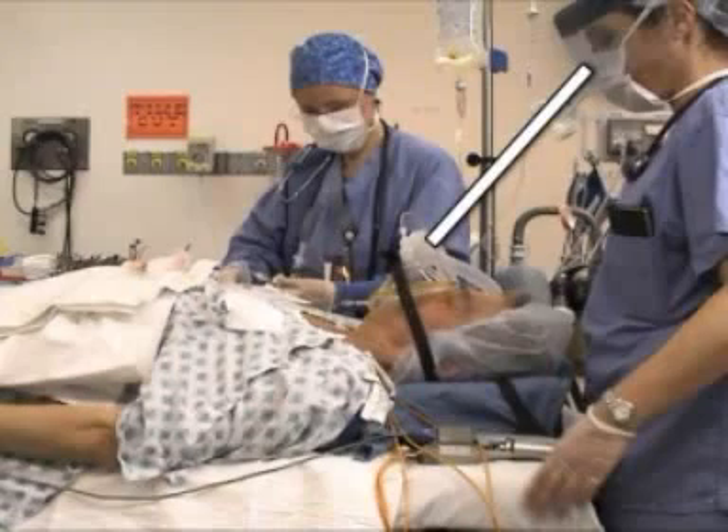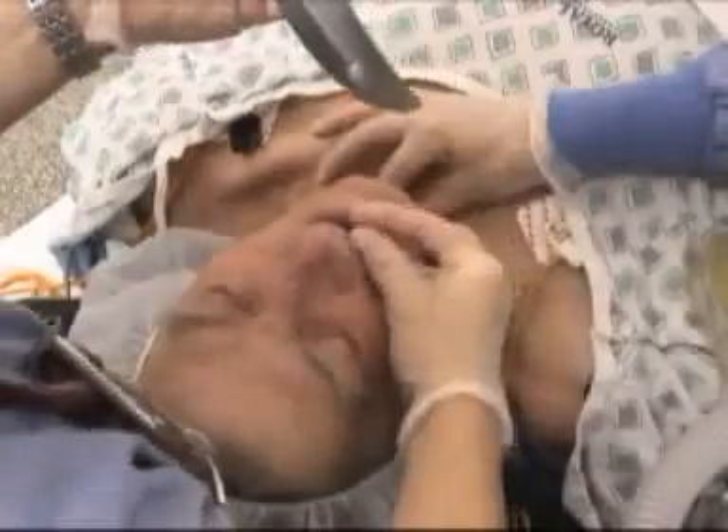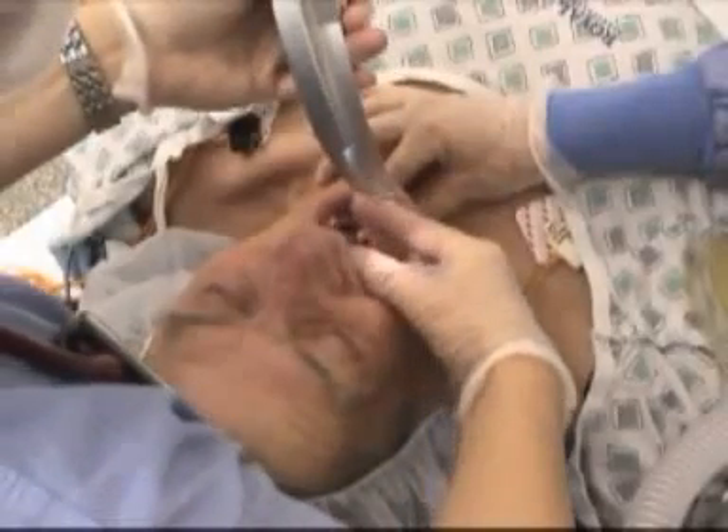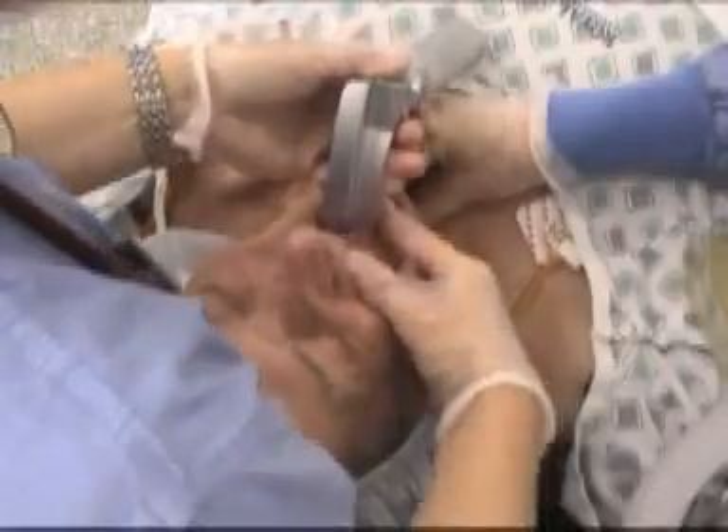Position your body so that your eyes are at a distance from the patient that facilitates binocular vision. Hold the laryngoscope in your left hand, blade down. Open the patient's mouth with your right hand. Insert the laryngoscope blade to the right of the patient's tongue.